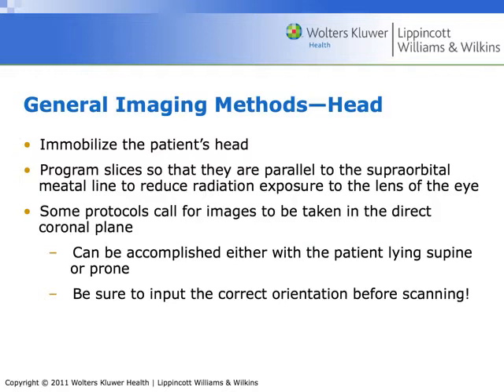This is a key part of communicating with the patient, especially if they're agitated or you suspect some kind of dementia or difficulty in comprehending instructions. You may have to stay with the patient and in some way assist in supporting them through the exam. But generally for most patients, just clear instructions will help them remain still.